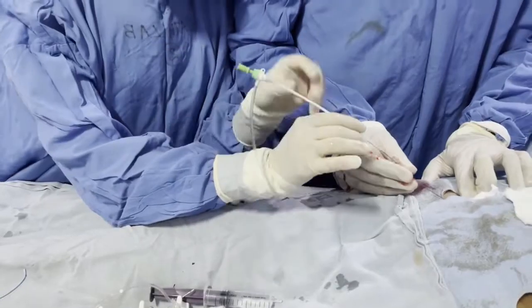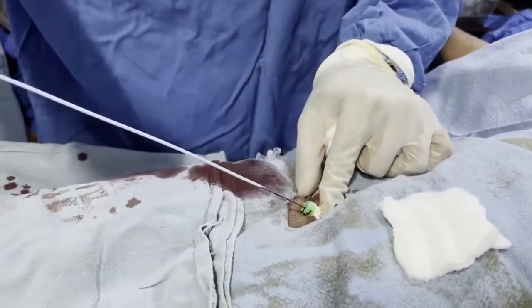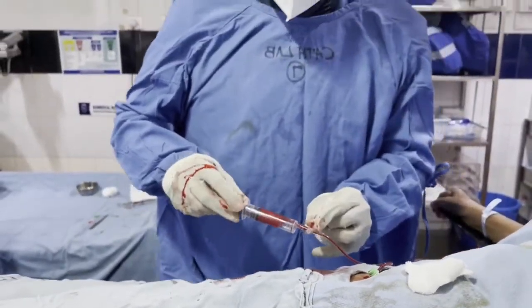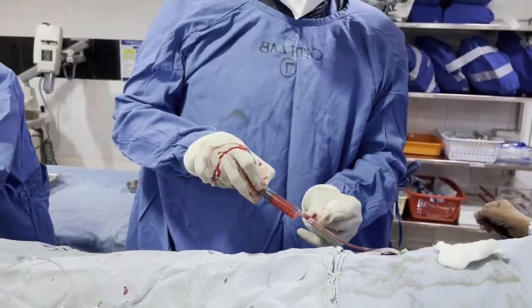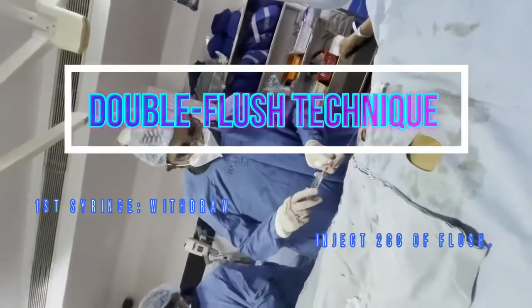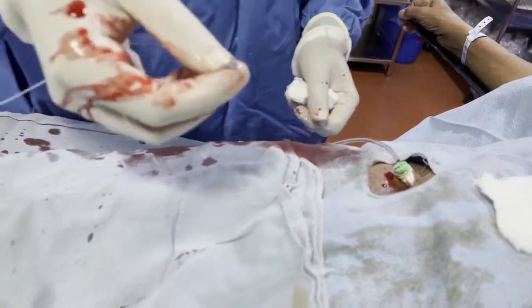We make a small nick so that the femoral sheath can be inserted. Here we have used a six French femoral sheath, inserted with a screwing movement. After that, we remove the dilator and now we have got the proper femoral line through the femoral artery. We check that the position is right and give a double flush to this region. I have given heparin injection so that the line is not getting clotted during the procedure, and then flushed with normal saline.